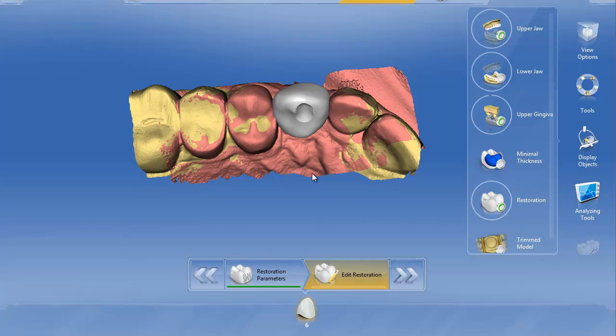You go ahead and mill this out, then finish that with a burr. Make sure your driver fits in there for the screw retained crown and you're finished. Hopefully this is a little tip to help you on these screw access holes.